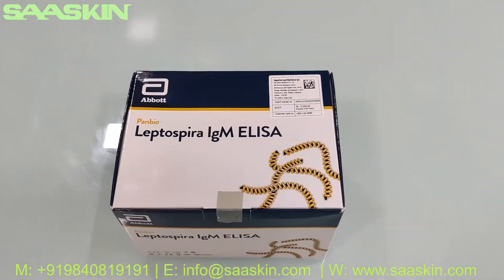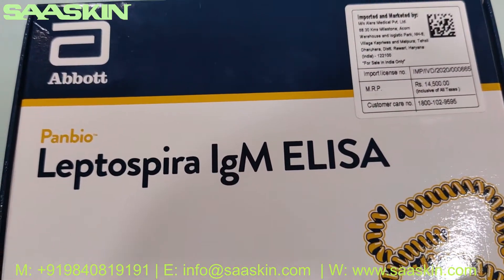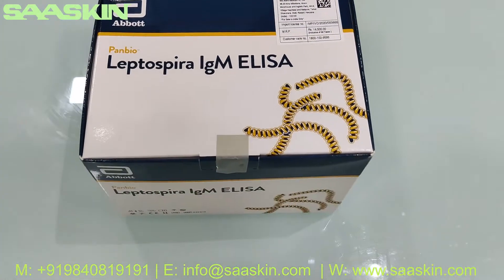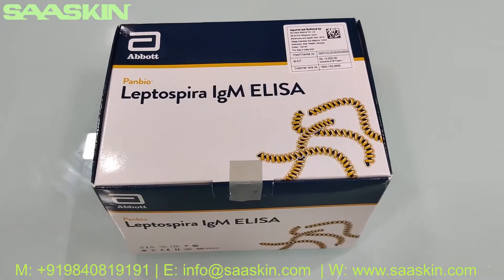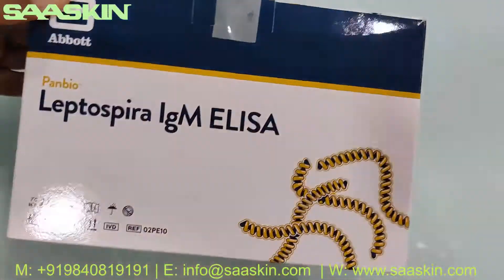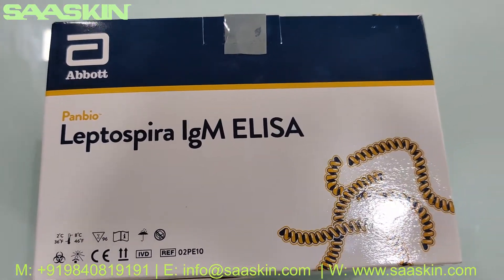Hello everybody, today we're going to see an unboxing of the Abbott Panbio Leptospira IgM Antibody ELISA test kit. This is a 96-well test kit. I'm going to give you an introduction about this box and show the contents inside. This is a completely CE IVD certified product.